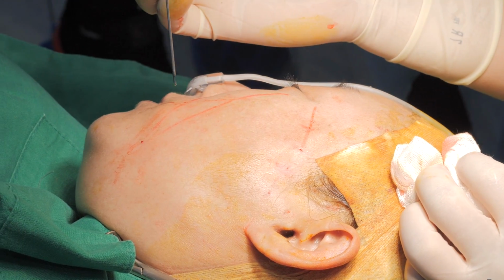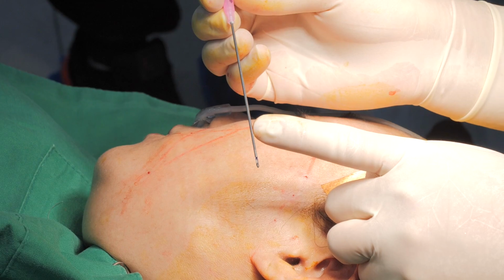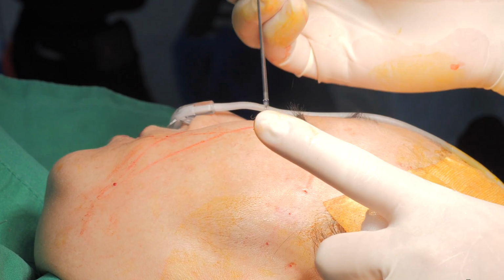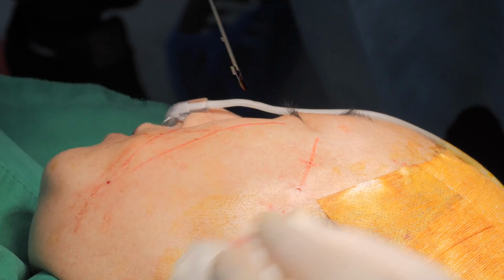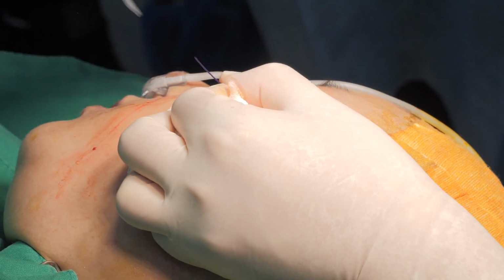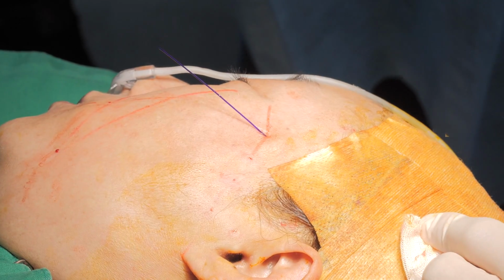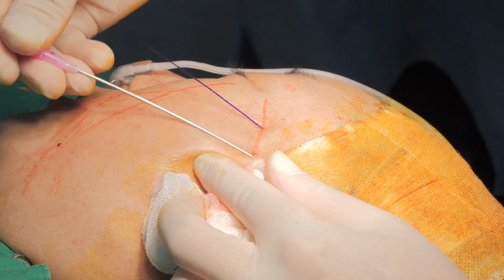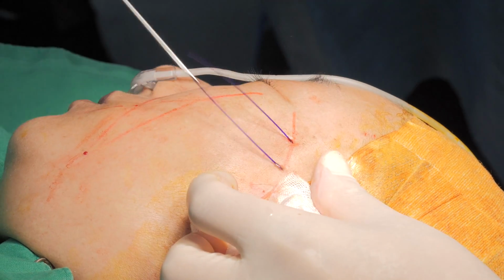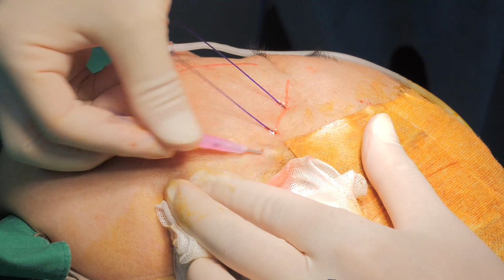Again, what's this? Cog master gear. It's a negative cog. Negative 6, right? It's a type negative 6, PDO. Yes. Medial. Oblique lateral. Lateral. Vertically upward.